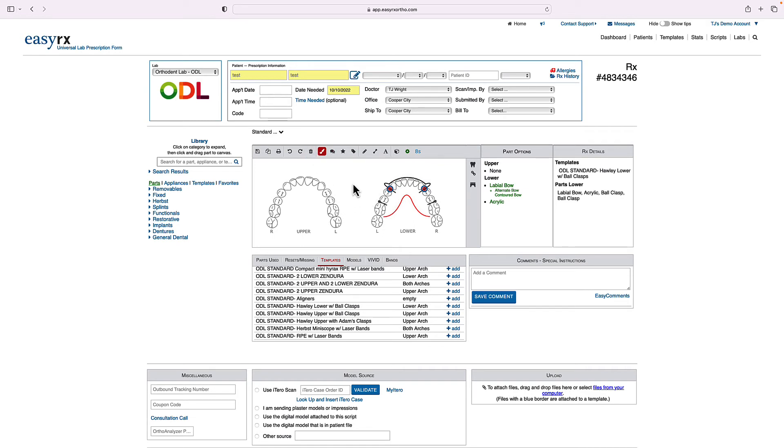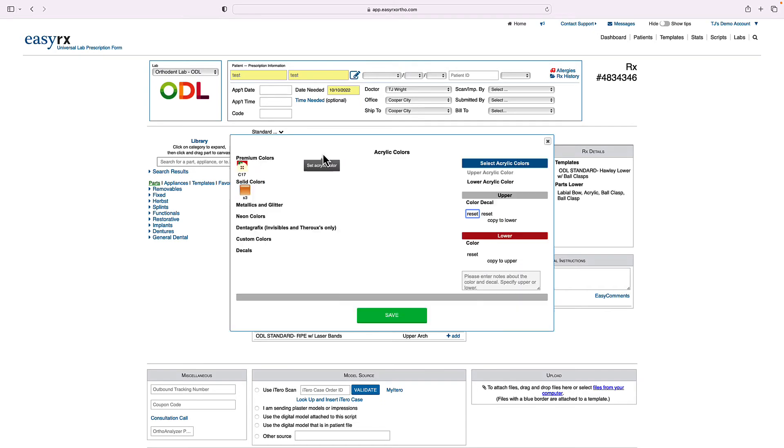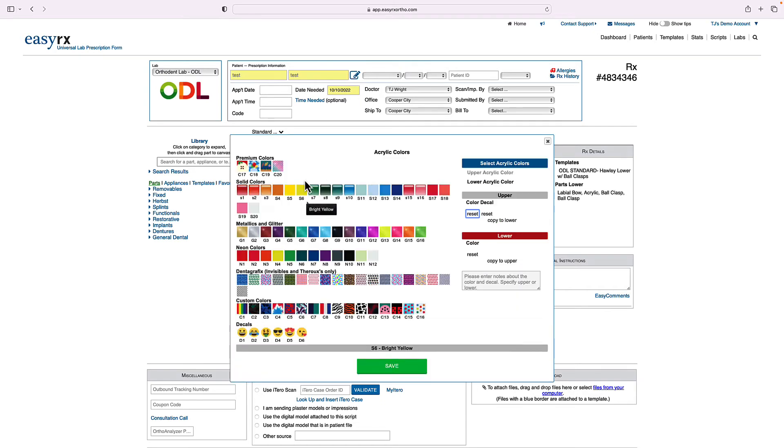Now, the last thing that needs to happen for any removable Holley appliance, any acrylic appliance is we need to select the acrylic color. So up here in the toolbar, it's highlighted red for you because the program knows that it's required and you're going to click select acrylic color.